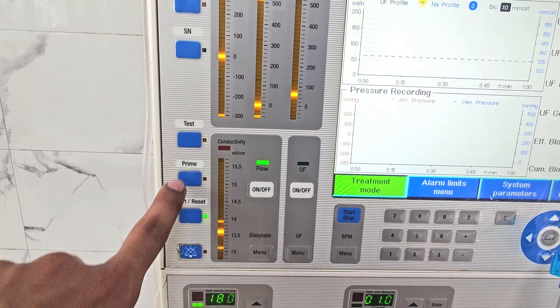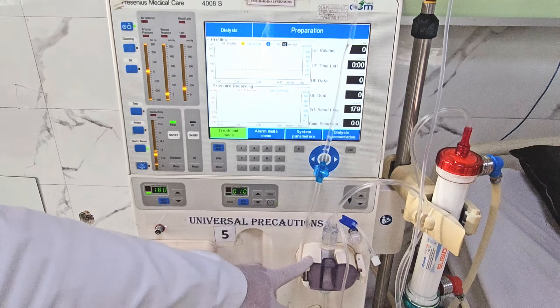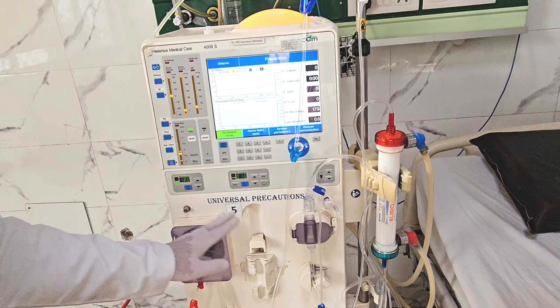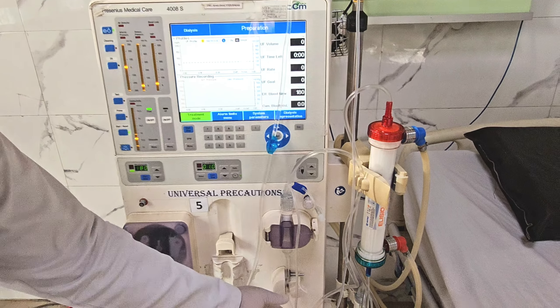Conductivity parameters and pressure parameters are being set to the appropriate levels and are displayed on screen. Next, the heparin pump will be connected.